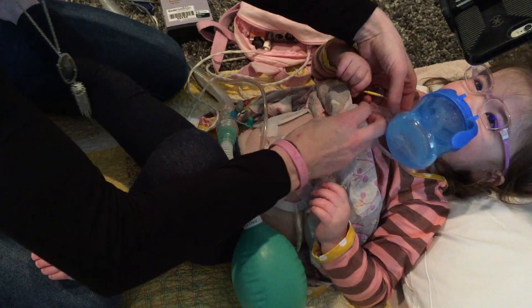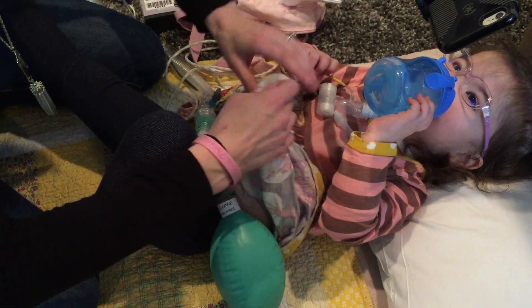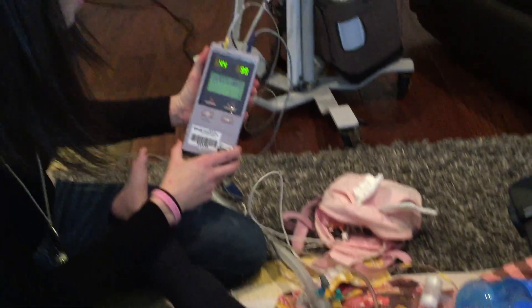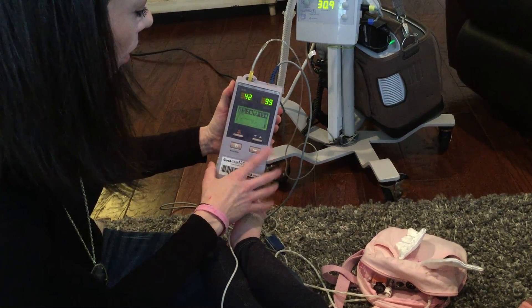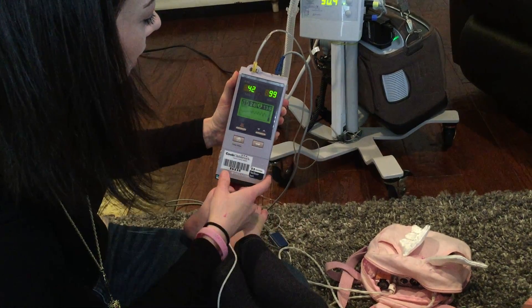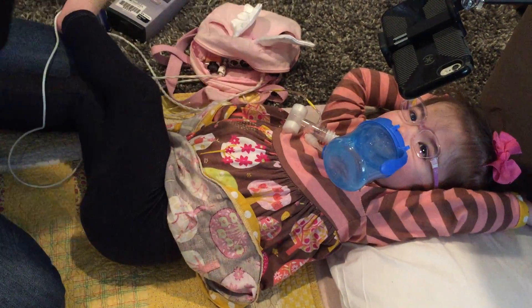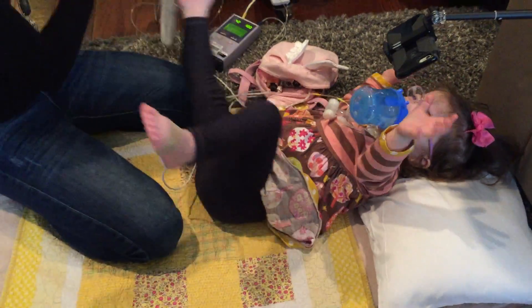Her HME is on. Right now I still have her on her CO2 monitor and pulse ox on her foot so I can make sure everything is going okay with her pacing. Her CO2 is 42, respiration rate is 26 — that's what the pacers are set at — O2 is great at 99, heart rate is good. This looks pretty good, so now I'll just turn off the ventilator and get that out of here.